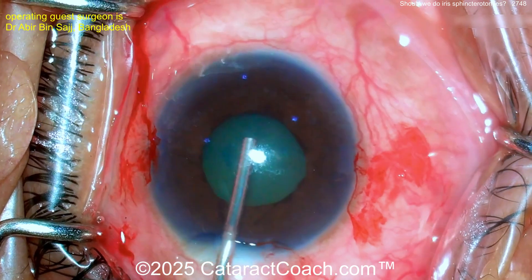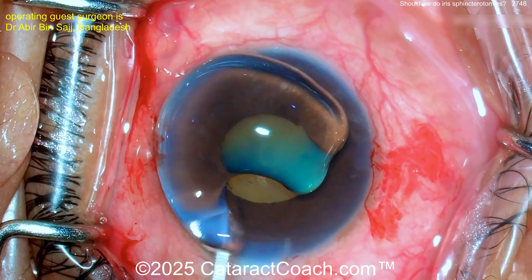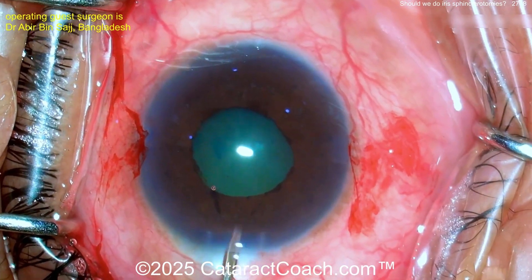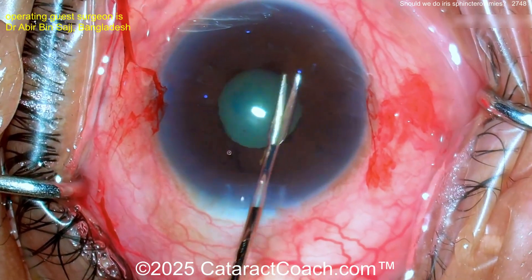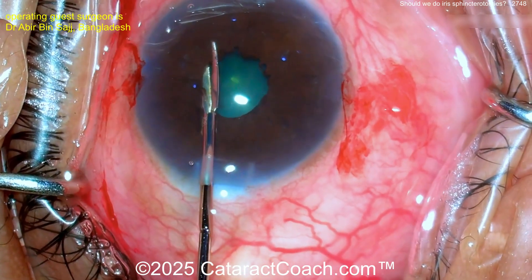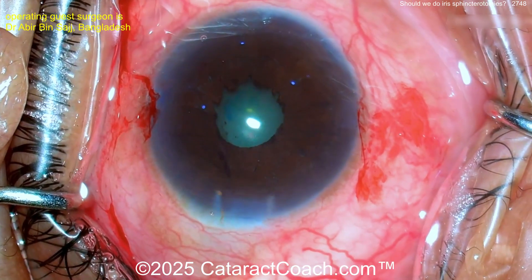So what do you want to do here? Maybe put iris hooks in, but if you don't have those either, what should you do? In a case like this, I would just do the phaco — that's a big enough pupil, you can make the rhexis under the iris as we know. But in this case the surgeon is going to elect to do some mini iris sphincterotomies, using micro scissors to make multiple small cuts at the pupil sphincter.